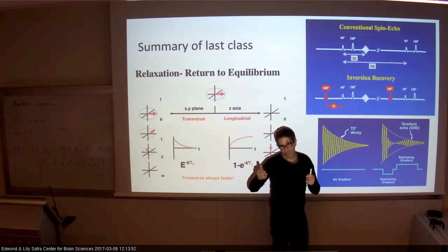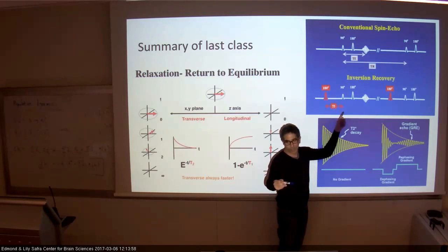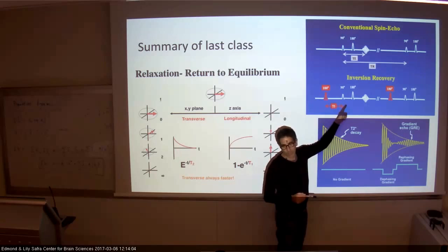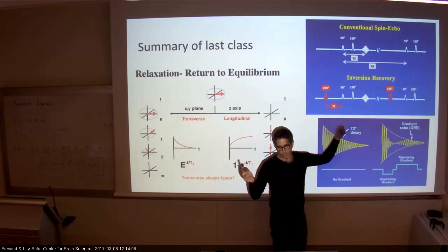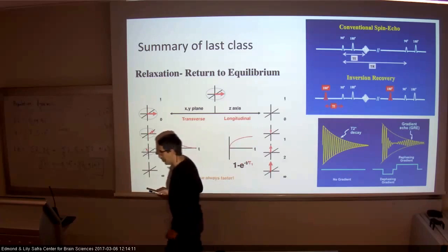I will get a different signal, a different projection, and that will be only a function of T1 and inversion time. So I'm going to flip, change the inversion time, right? And I will fit an exponent that explains the T1 relaxation, because each time we get a different weight of the T1. Okay, I'm going to move on now.